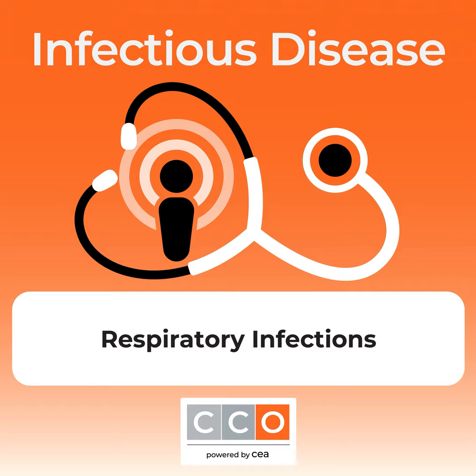So how can, for example, the lower respiratory tract infection panel guide or change your antimicrobial therapy? One way is that it could detect resistance genes that may change your empirical therapy. Probably the most common example is that you detect the mecA gene, and that confers methicillin resistance in Staph aureus. So if you have this mecA with MREJ and a Staph aureus detected, you know that that's an MRSA. Of course, this is important because for a patient who previously was not started on an anti-MRSA drug like vancomycin or linezolid, that could be added to their care. And you would get this information much more quickly than waiting for culture and antimicrobial susceptibility testing.